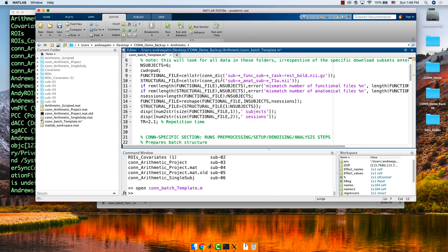This script uses both MATLAB commands and CONN commands. If you're not familiar with MATLAB, don't worry too much. But for those who do have some background — this con_dir command here is from the CONN library. It's going to recursively search from your current directory for any files matching this regular expression. In my case, it had sub01, sub02, sub03, sub04, sub05, sub06 — it grabs all of those and puts them into a cell string.